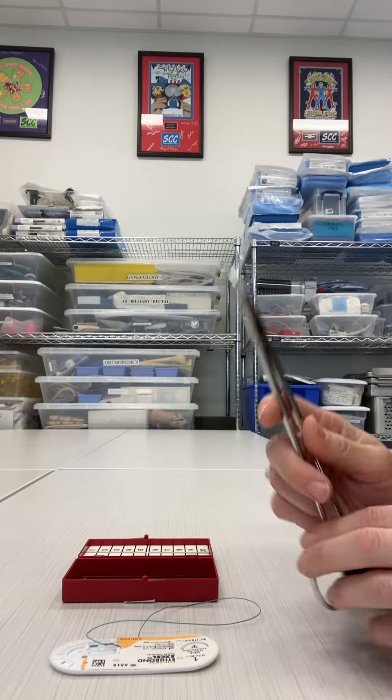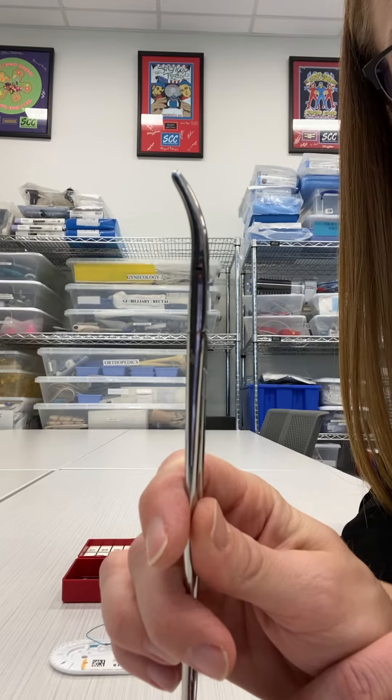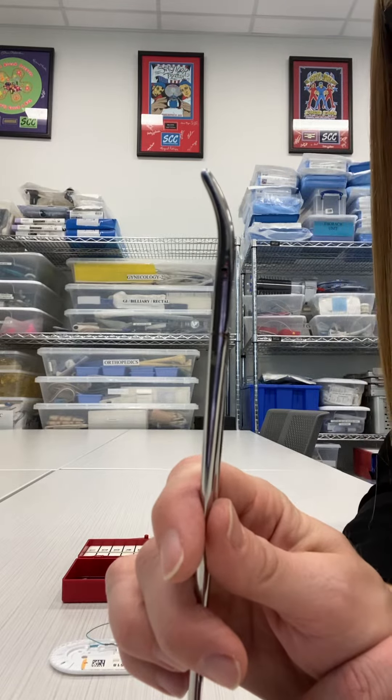This video is going to show how to load a Haney needle holder. A Haney needle holder is that curved needle holder that we utilize for GYN procedures, mainly in the vaginal canal.